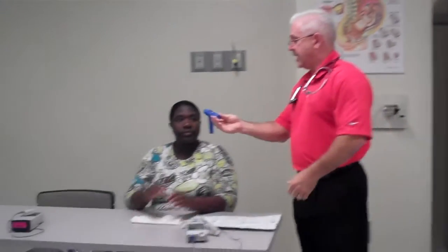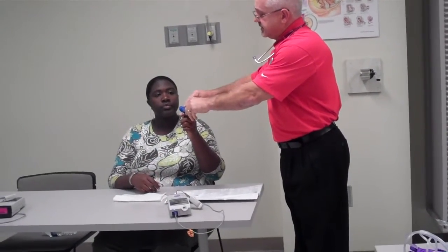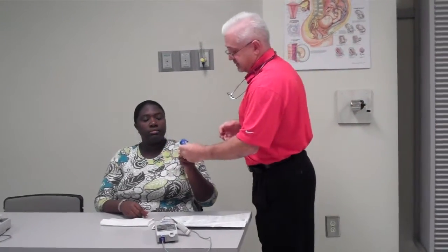At this point too, I would have the patient repeat her peak flow. And what I need you to do, Miss Stacy, is put this back in your hand, push this flow indicator all the way to the bottom. Again, take a deep breath in as much as you can, put it in your mouth, bite down, and blow out hard and fast. Okay, great. And we would do 3 times, and this time Miss Stacy's peak flow was 450.